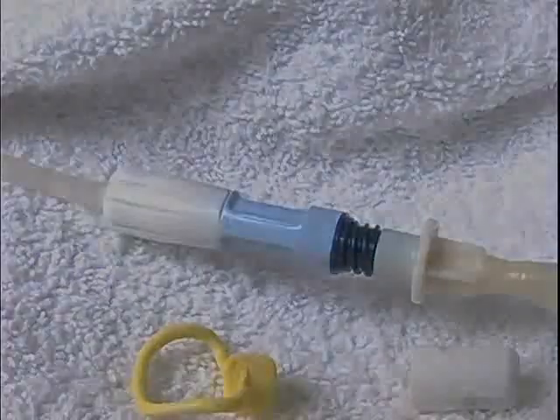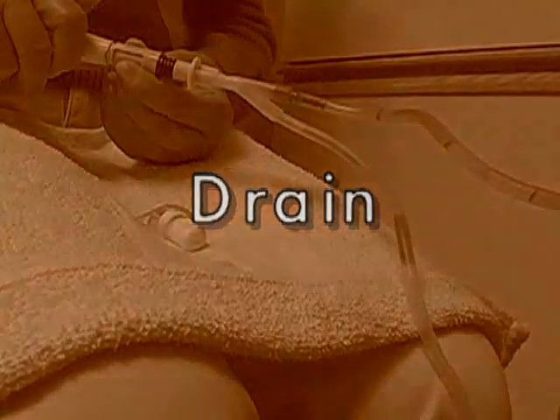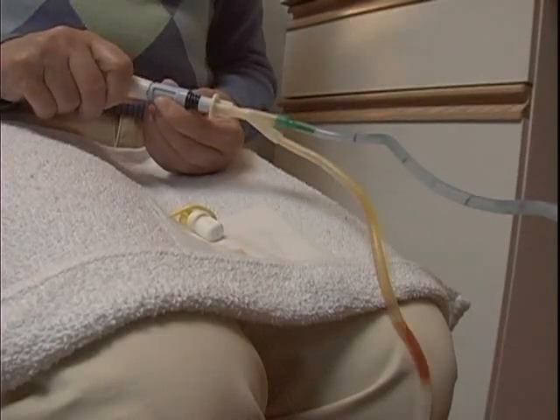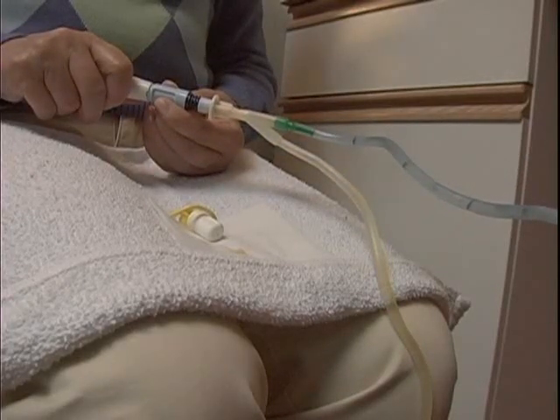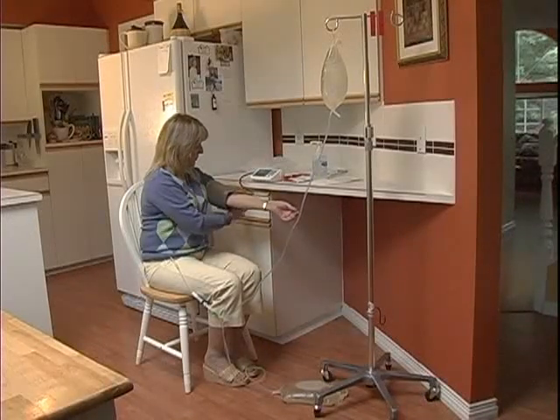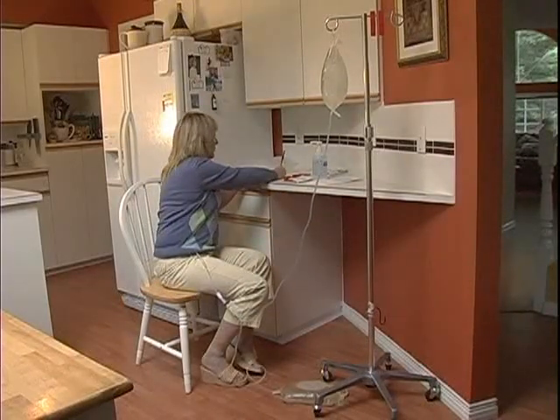You are now ready to begin draining. Open the transfer set twist clamp to drain. The fluid should start draining out. This can take up to 20 minutes. If it is your first exchange of the day, while you are draining, you may take your sitting blood pressure. Log the results on your CAPD log sheet.